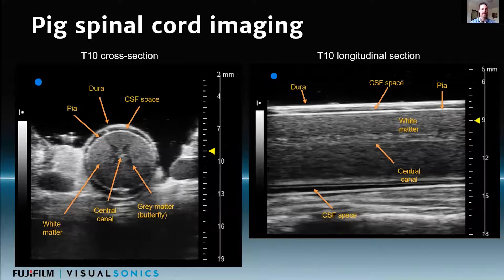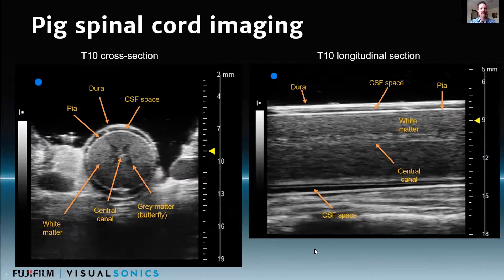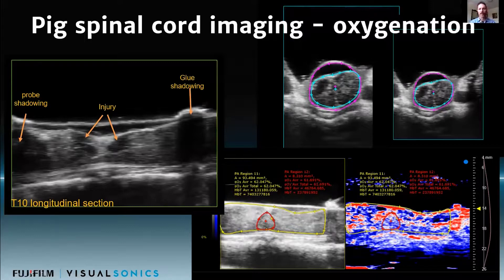Deviating a bit now — in this case we've got a pig spinal cord model where a laminectomy has been performed, the spinal cord is exposed, and the transducer is dropped down into the wound to image. The resolution is unbelievable — this scale is in millimeters, about 8 millimeters across diameter, and you're really able to see small structures: the dura, the pia, the CSF. Here's a cross-section and a longitudinal section of the spine. This was an injury model — a crush injury — looking at what happens morphologically and also doing functional measurements of oxygen saturation in that area after injury.